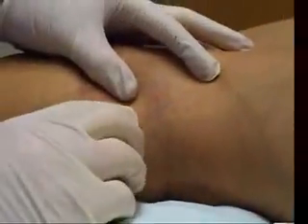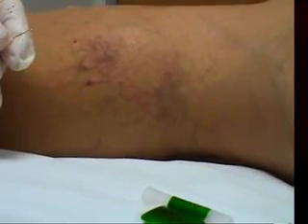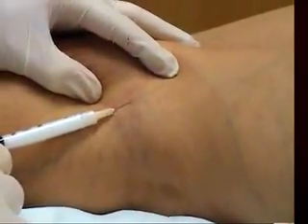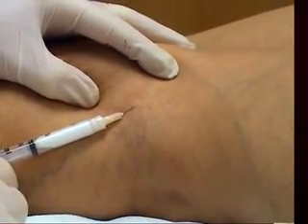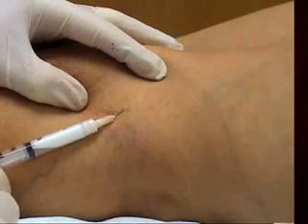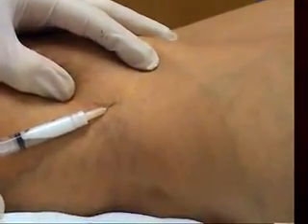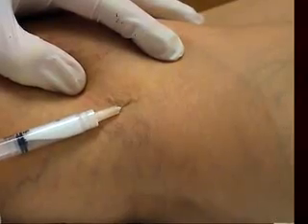Right, we're going to do this area here. Now you see this is a larger reticular vein underneath here with some lighter pink vessels associated. Many people say that you've got to get the reticular vein first. I don't know how valid that is, but that's what people say. So let's just do it. So that's pretty much about as good as it gets in terms of being in the vessel. Again, don't press too hard on the syringe, otherwise you'll extravasate. But you see all those teeny vessels now look white. It looks like a topographical map.